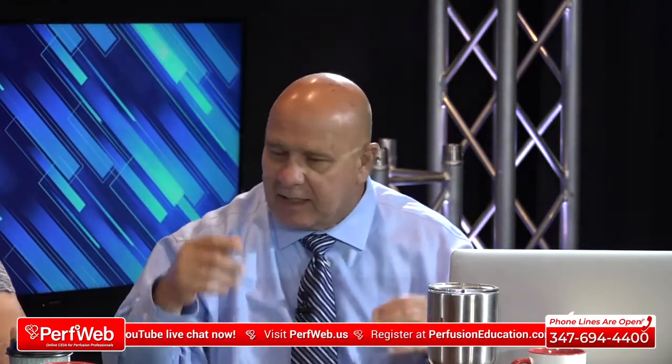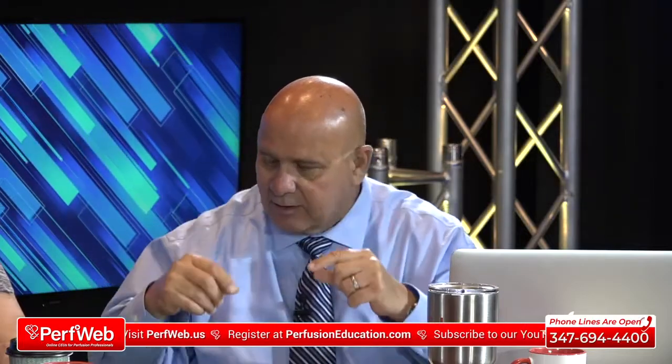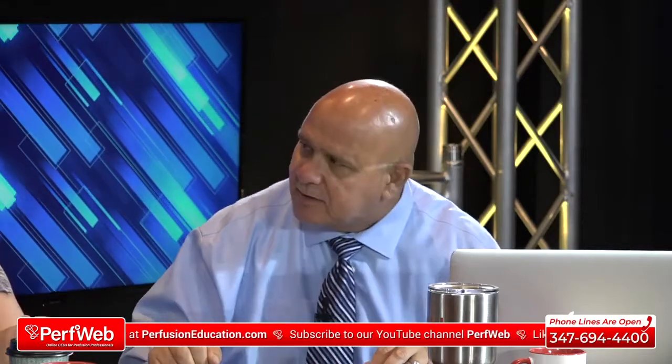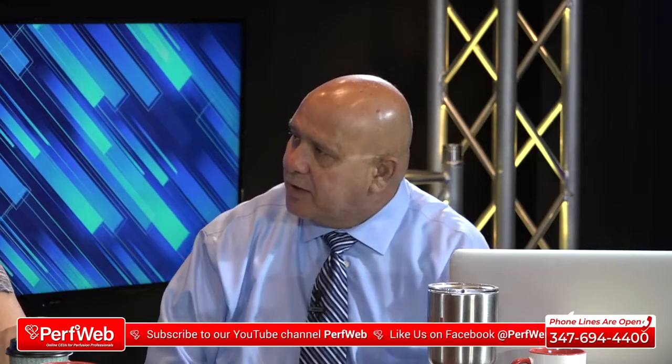Have any of you used NIRS, the near infrared spectroscopy, or what do you call that thing that they put on the forehead? Not the BIS, the other thing. Cerebral oximetry. Sorry, yeah, that's what I meant, NIRS. Cerebral oximetry, where I've seen them put it on the legs and stuff. Do either of you have that experience? I've used cerebral oximetry where I came from. We used it on every heart case and tracked it, but never seen it used anywhere else. Do you have confidence in the device?